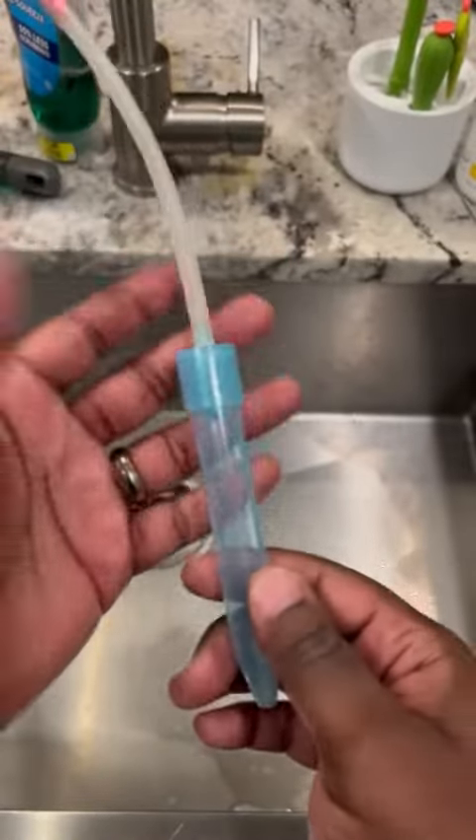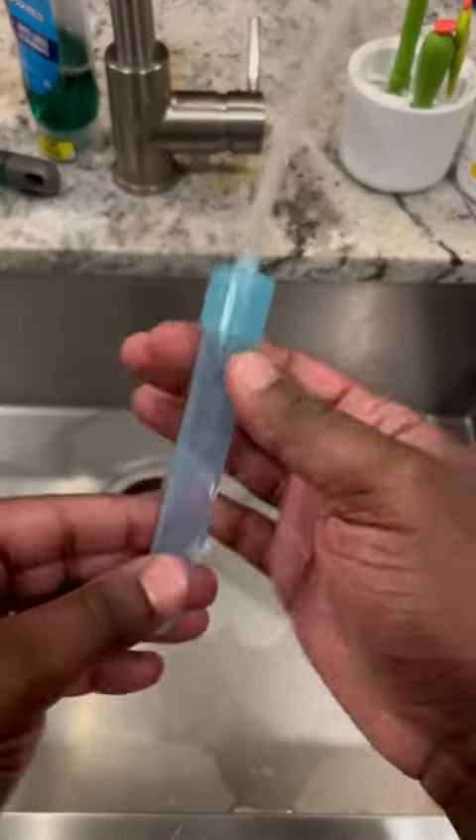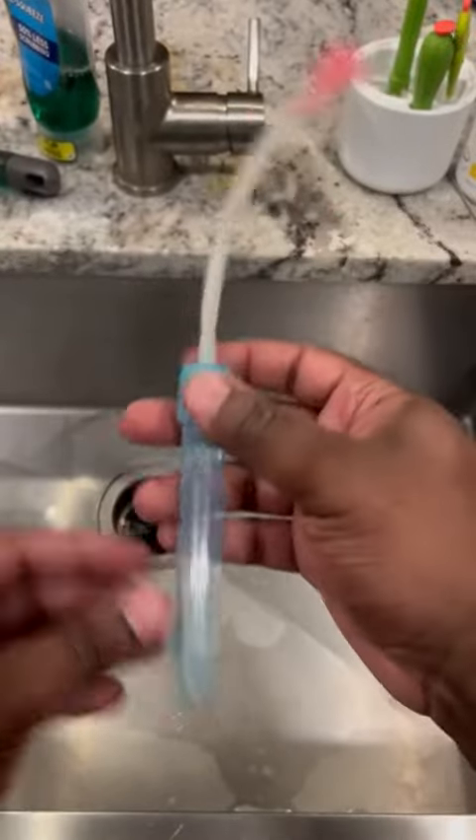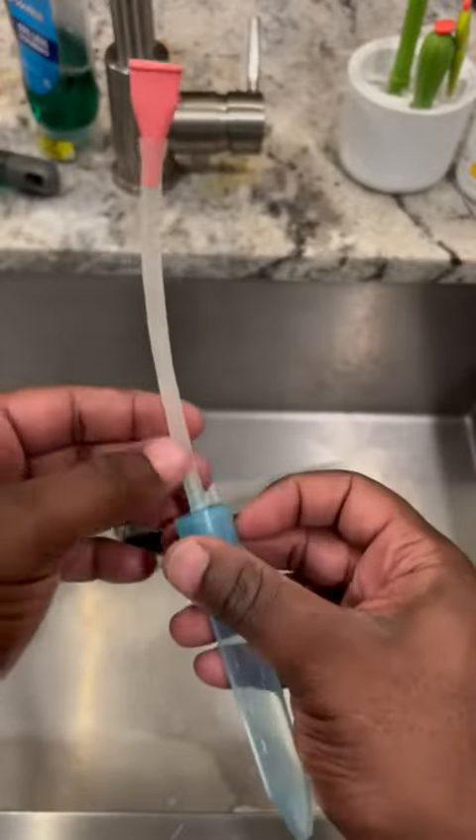We've been using this pretty much exclusively when it comes to snot because it does really well with snot and it's super simple to use. You can cut this tube to whatever length you need and it's really easy to clean.